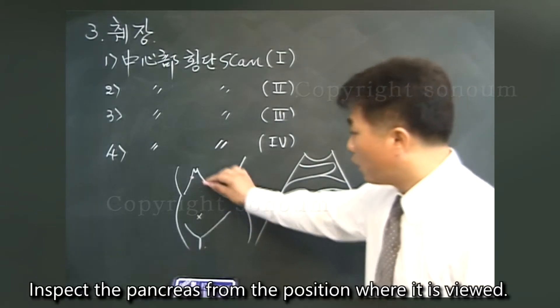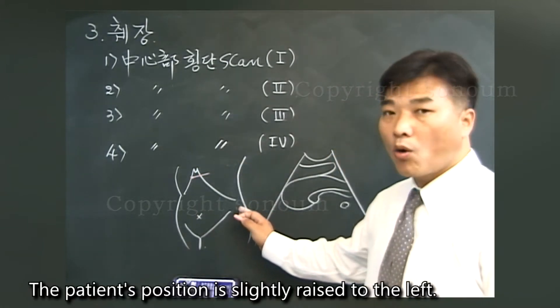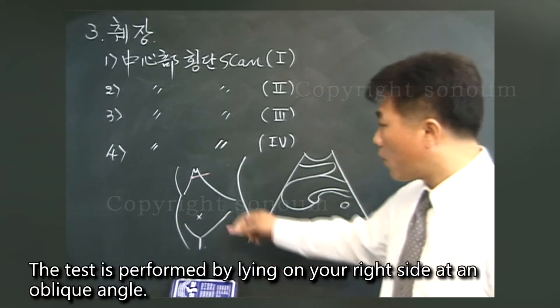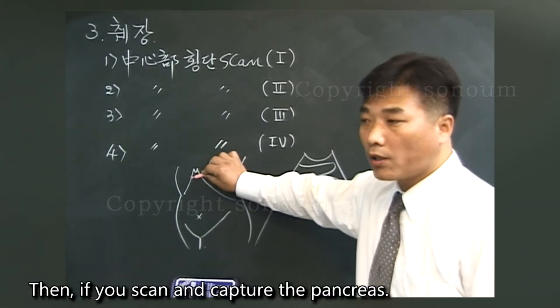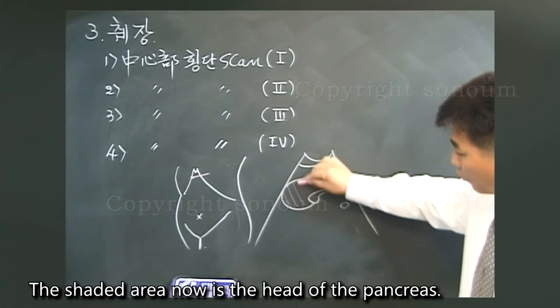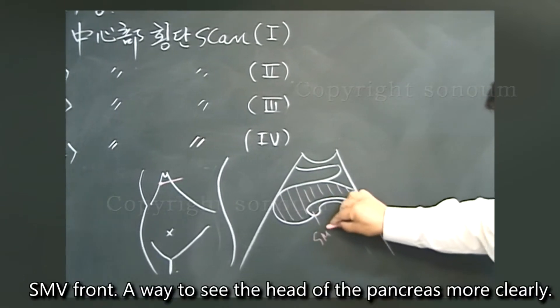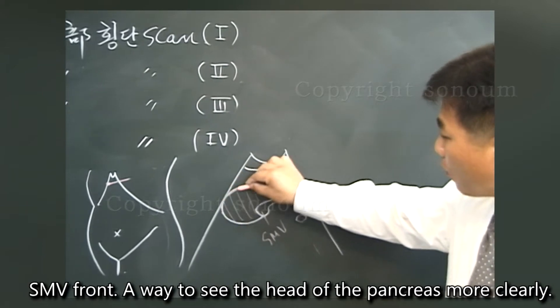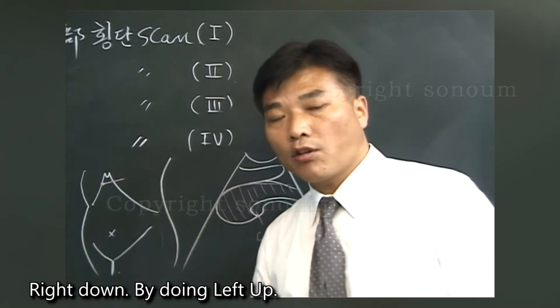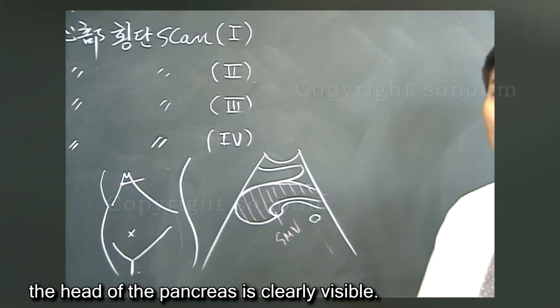To inspect the pancreas, the patient's position is slightly raised to the left toward the inspector, and the test is performed by lying on the right side at an oblique angle. When you scan and capture the pancreas in this way, the shaded area displayed is the head of the pancreas, then the body and the SMV in front. By tilting left-up at a 45-degree angle, the head of the pancreas is clearly visible.